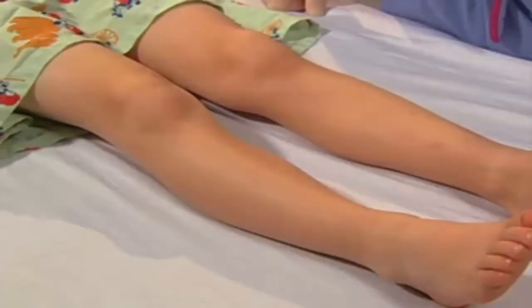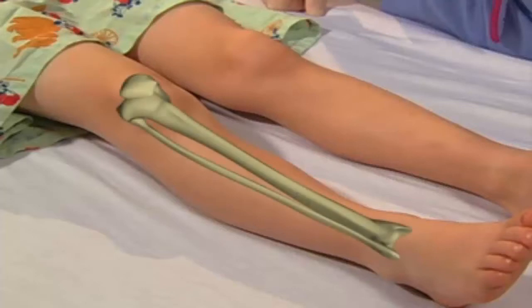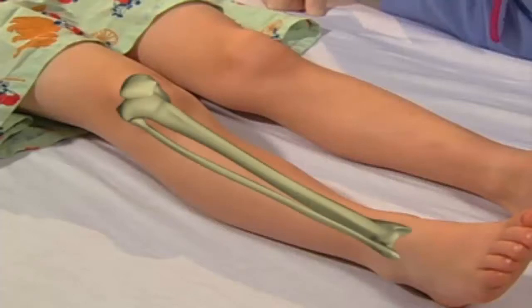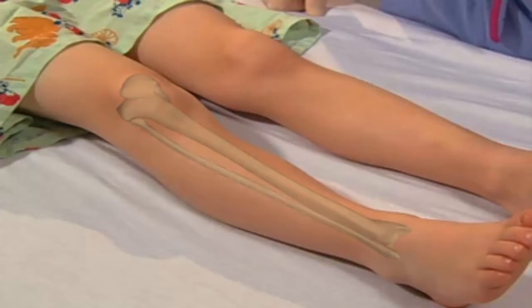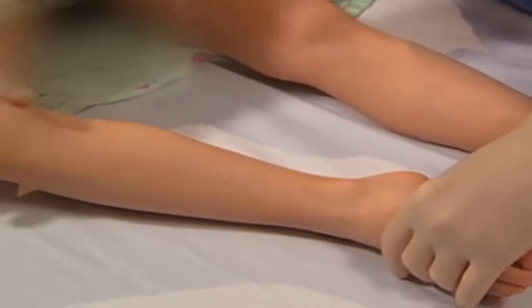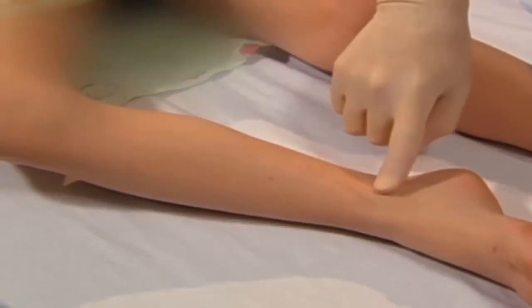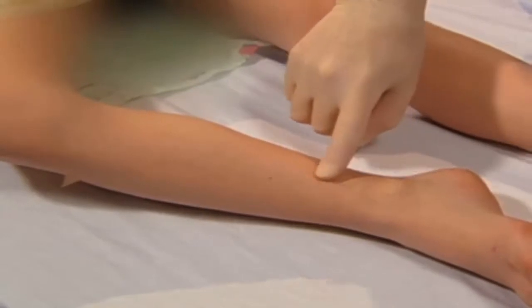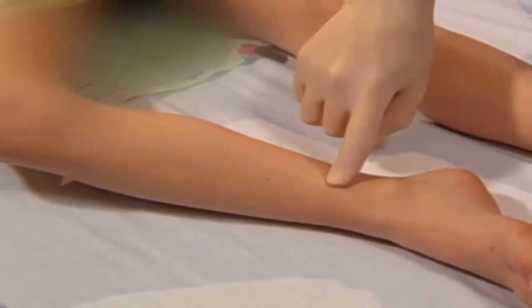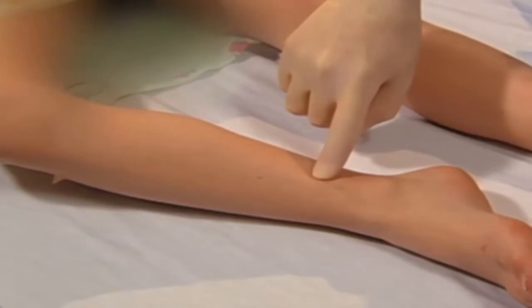The distal tibia has easily palpable landmarks in most patients. It has less cortical thickening than the proximal tibia, so it is preferred in older children. Place the hip in a frog leg position to expose the distal tibia. Identify the medial malleolus; the intraosseous insertion site spans the flat portion of the tibia, one to two centimeters proximal to the superior margin of the malleolus.